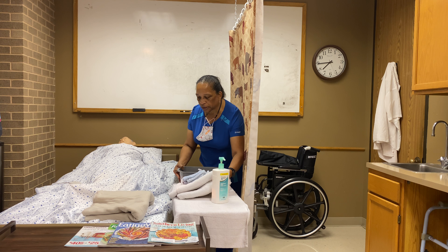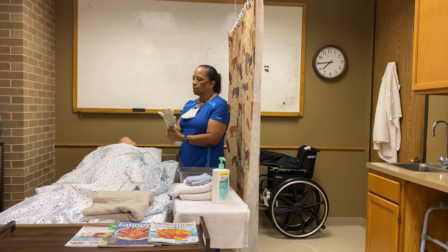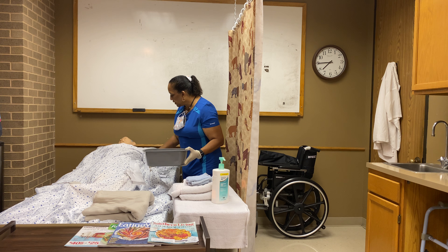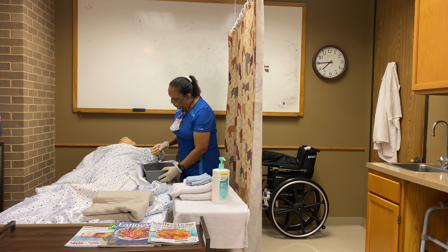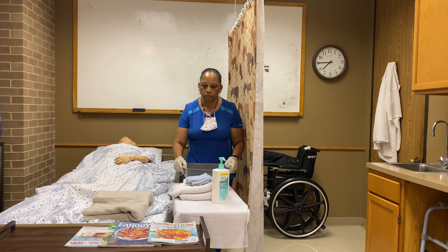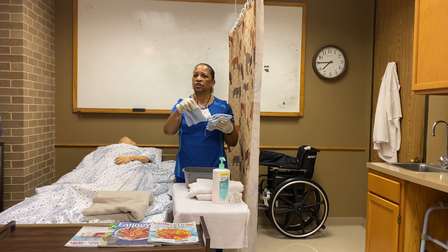Miss Mary, I'm back. I have some water here. Before I have you test it, I'm going to put my gloves on. Can you test the water to let me know if it's comfortable for you? How's that? I have a paper towel you can use to dry your fingers. I'll set the paper towel aside and put it up at the end.